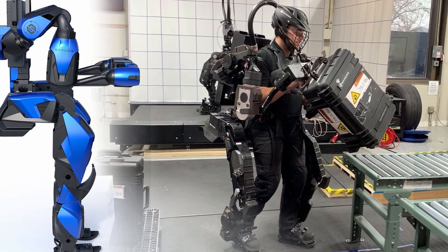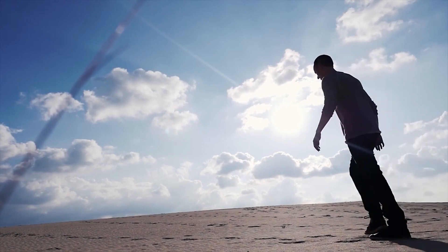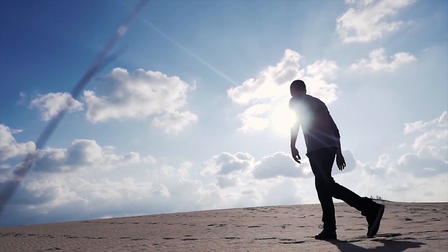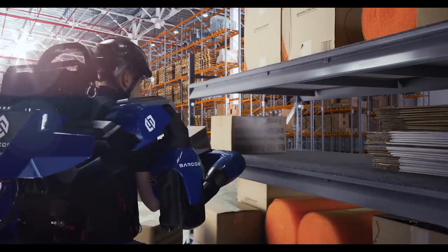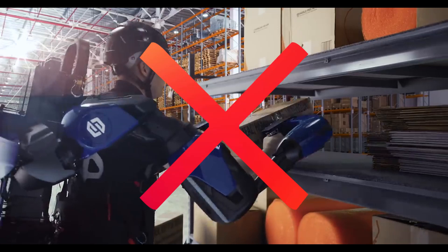Powered exoskeletons have motors — typically electrical motors like these ones — and you want to move these motors in harmony with the user's body. You don't want the user to move an arm or a leg only to have the motor doing a different movement, with potential risk for injury. That's why we need proper control of these machines.